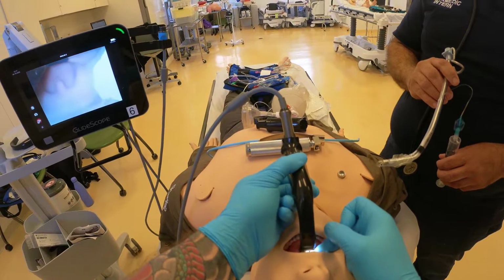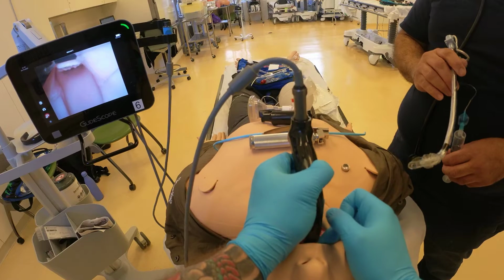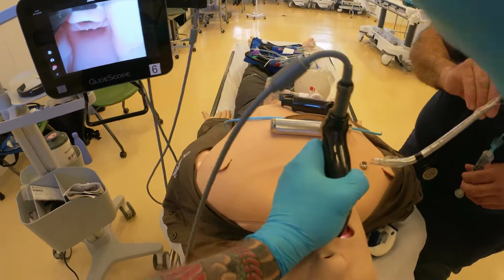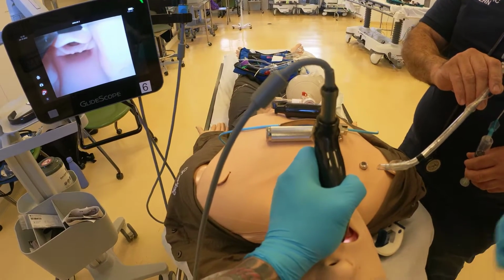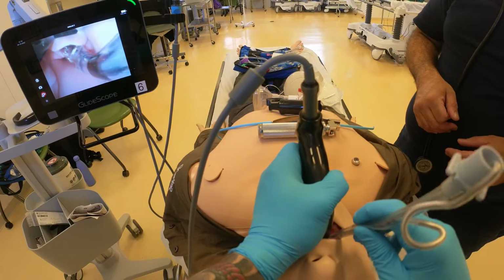Uvula is the first landmark. I see it, I go forward. I want to see the epiglottis. I see it. Slide my blade into the vallecular space. Hyoepiglottic ligament. I see my interarytenoid notch. Not 100%, 50%, coming from the side, and go straight.